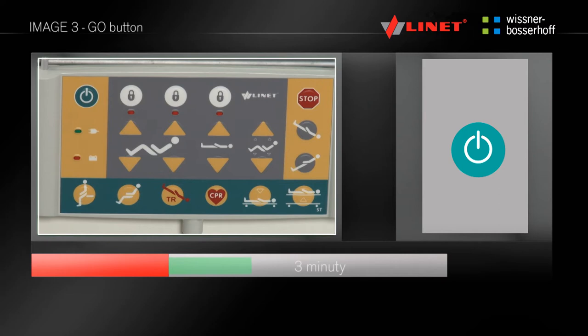In the event that within 3 minutes no electrical function of the bed is used, the bed is automatically deactivated, and before the next bed positioning it is necessary to press the go button again.